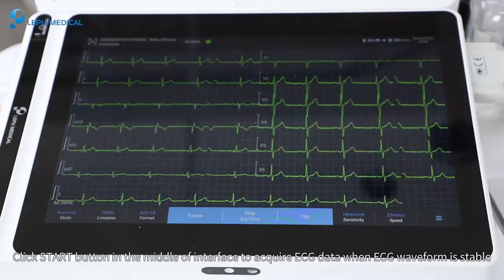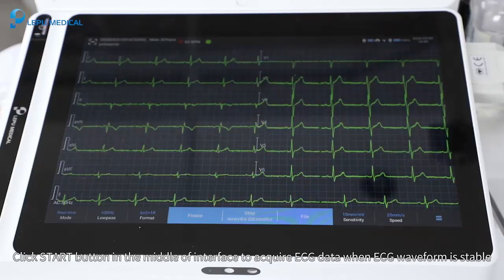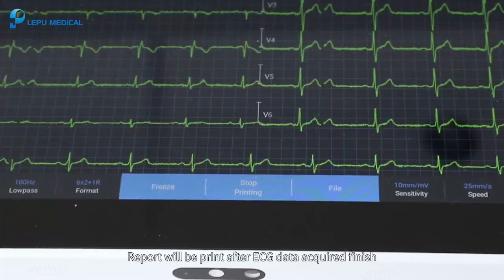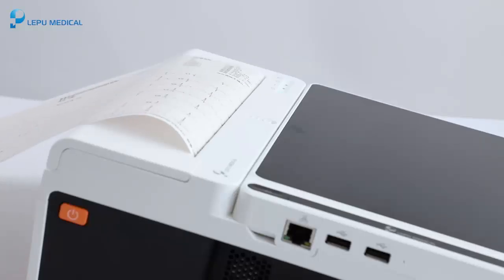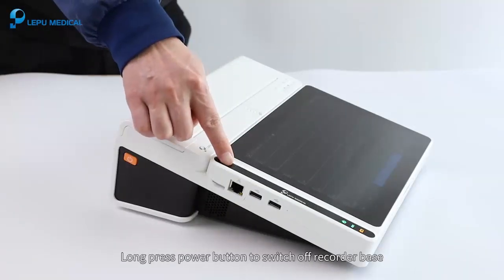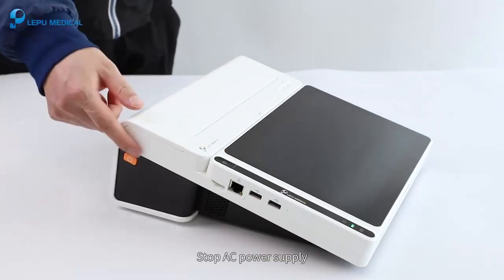Click the start button in the middle of the interface to acquire ECG data when the ECG waveform is stable. The report will be printed after ECG data acquisition is finished. Long press the power button to switch off the recorder base, then stop the AC power supply.